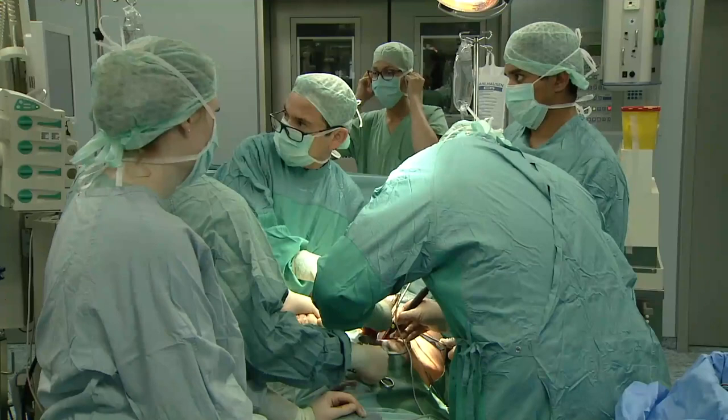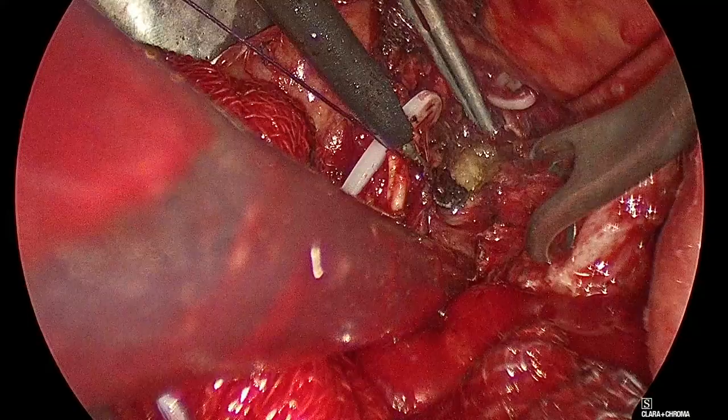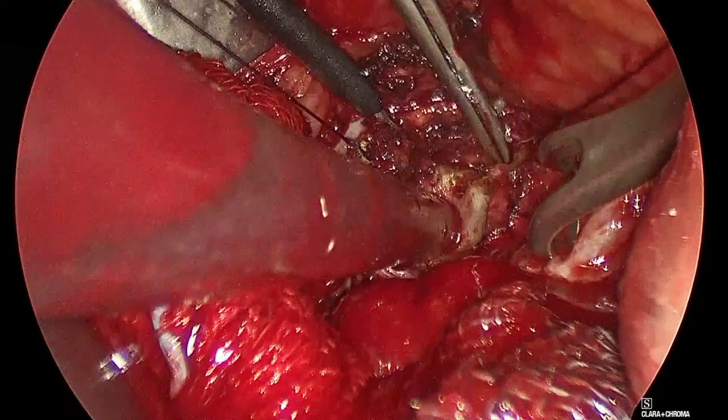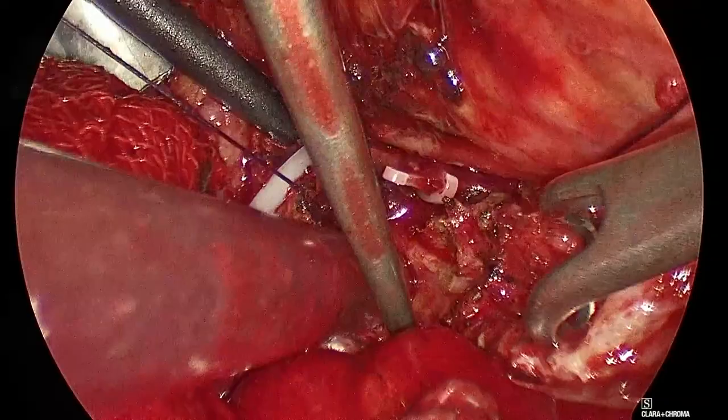So just for you to see the end of the surgery, I'm sorry that it was not a beautiful one, this part, but I don't know, this lady was absolutely, I don't know what to say, but we are at the detrusor muscle out, and this is the open bladder. So we are at the cuff, finally.